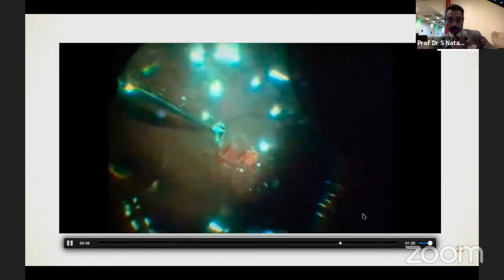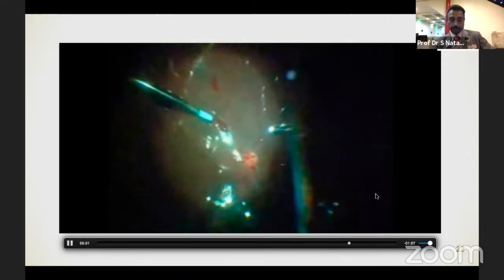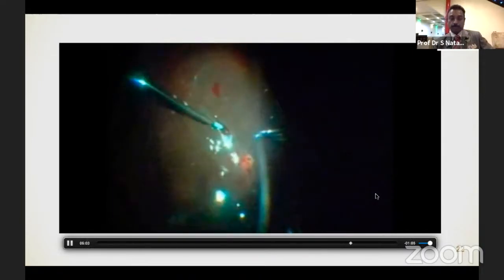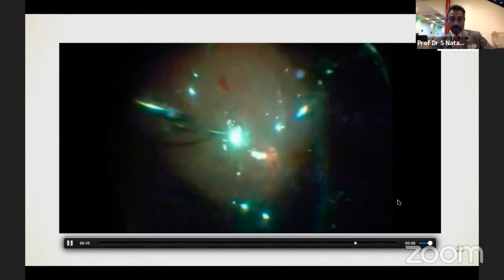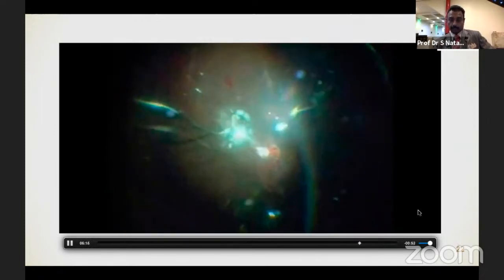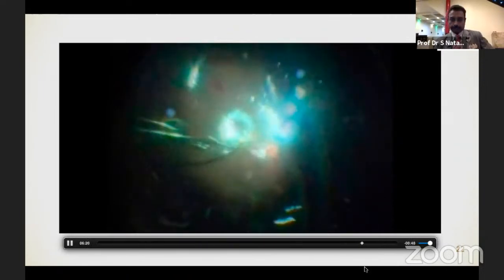I want everybody to know the chapter written by Dr. Jovanovich, the use and abuse of silicone oil. Many times people think that you inject oil and you can solve the issues, but actually you can increase the problem. You can see the retina is flat, the optic disc region is fine, and you're now doing the laser around it. You're doing endolaser around the retinal break, and the retina is totally reattached. And then the eye is replaced with the gas.